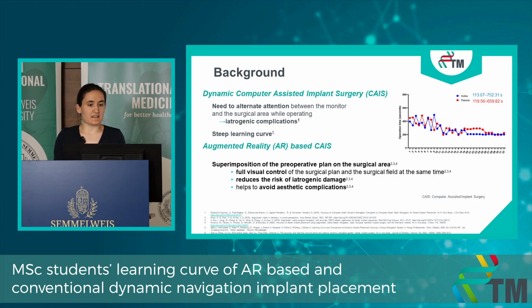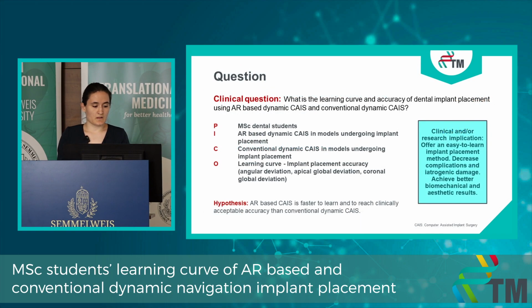However, there hasn't been any studies about augmented reality's learning curve. So this is why we would like to see it. We only know that dynamic navigation has a steep one. We would like to conduct this study with MSc dental students, and the learning curves would be formed measuring implant placement accuracy. And the hypothesis is that AR is a faster to learn technique and to reach clinically acceptable accuracy.